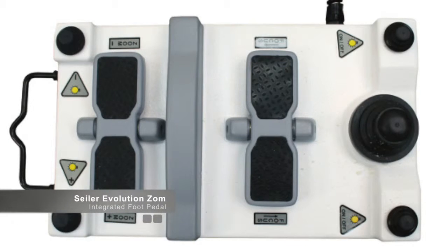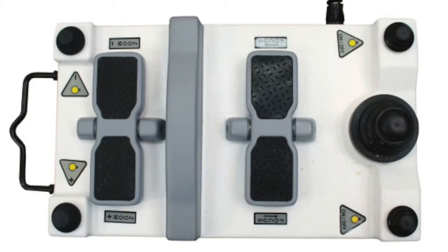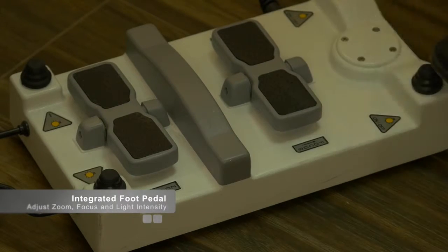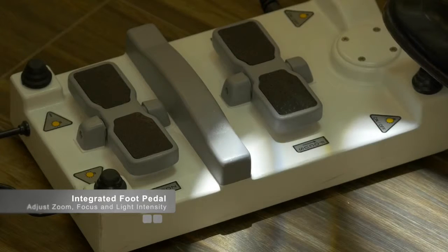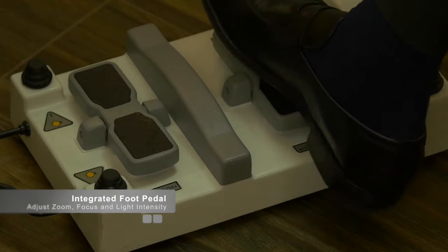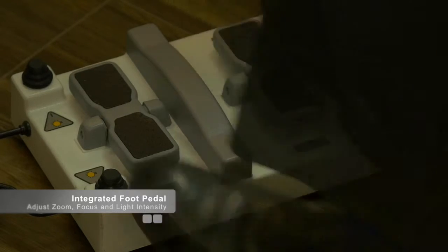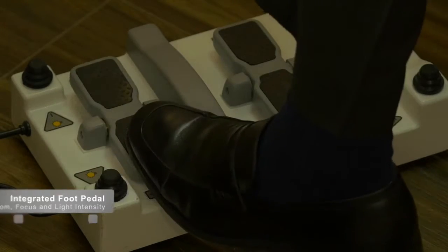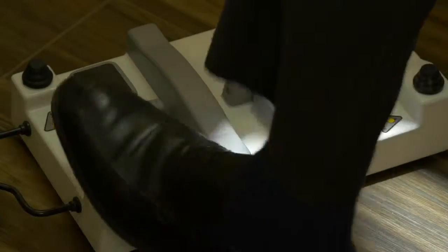If the clinician's hands are occupied and involved in the procedure, and moving the hands out of the operative field is not desired or is inconvenient as it will disrupt the flow of the procedure, a foot pedal is available that allows the operator to adjust the focus, magnification, as well as light intensity, all while keeping the hands occupied in the procedure. These are the same features that are controlled by the motorized unit mentioned previously. However, these can be controlled without the use of the clinician's hands.